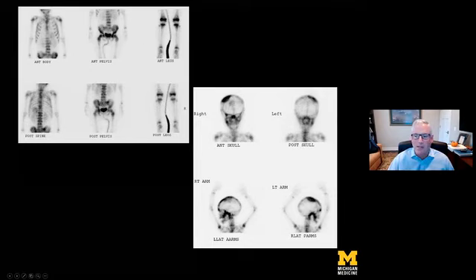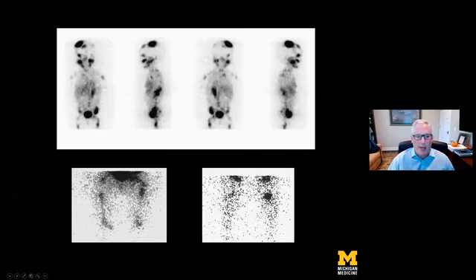So in this case, if our MS patient had this bone scan, they would no longer be MS, but M. However, if their bone scan was normal and they had just an MIBG scan, meta-iodobenzylguanidine, a norepinephrine analog that is used for imaging with typically iodine-123, then you would say that this could still potentially fit.